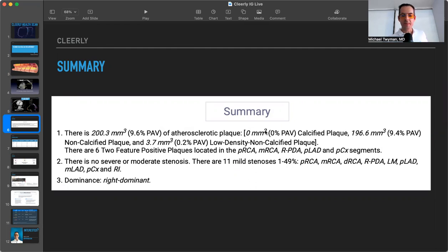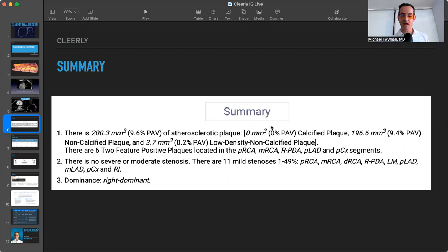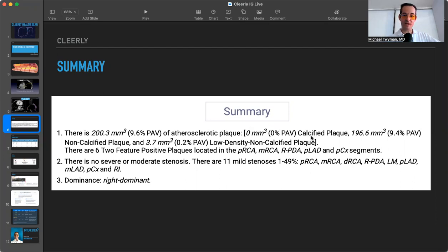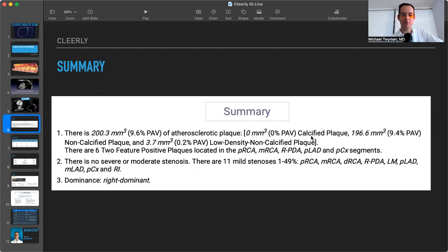So the real game changer for this type of test is quantifying what that plaque actually is. So there's 200 of it or so, none of it is calcified. So this individual is going to have a quote, normal calcium scan. And that's great. That just means not late to the game with hard calcified plaques in their arteries.